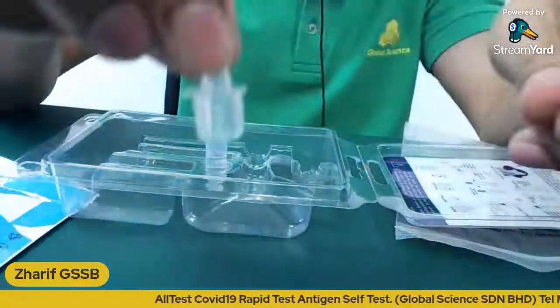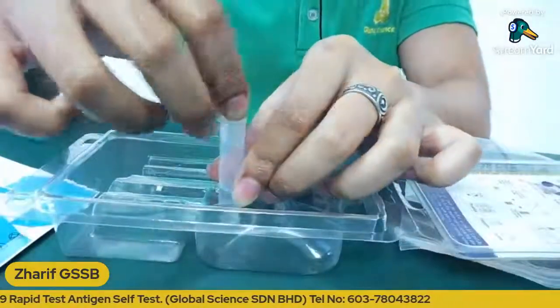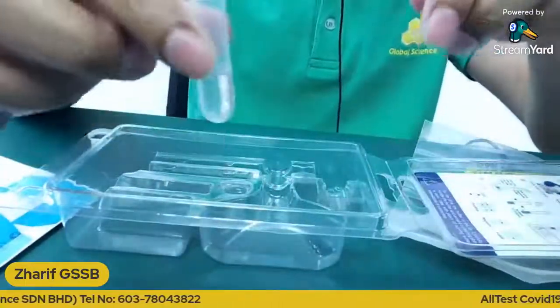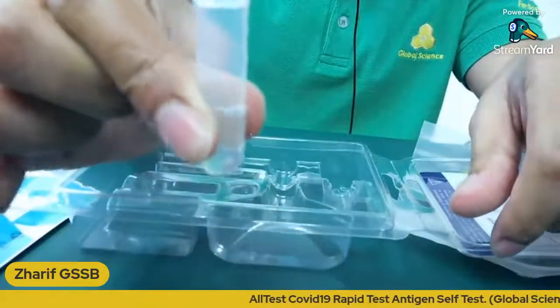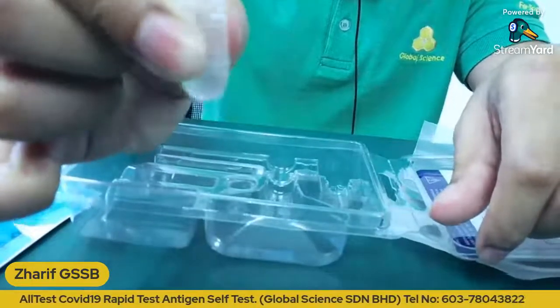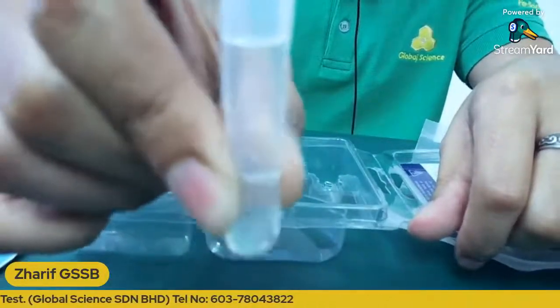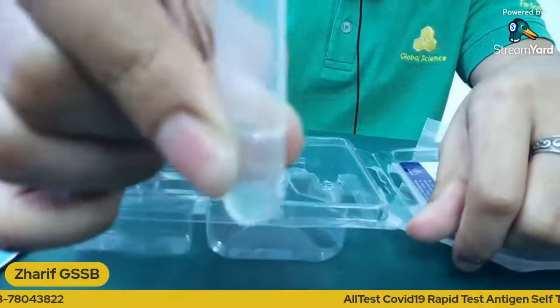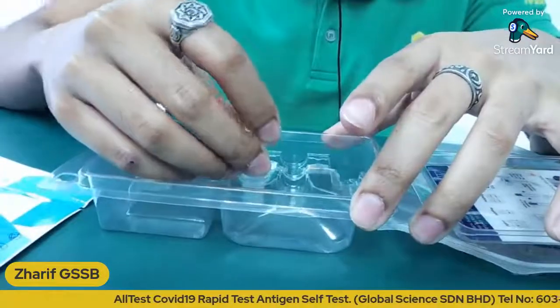And then you can attach the cap onto the tube. And for you to mix the buffer and your saliva, you don't need to shake it, you don't need to stir. All you need to do is just gently squeeze the tube. And make sure to squeeze around 10 to 15 times. 3, 4, 5, 6, 7, 8, 9, 10. And then you can place it back on the package.